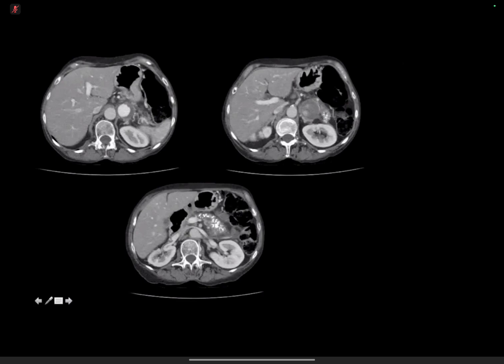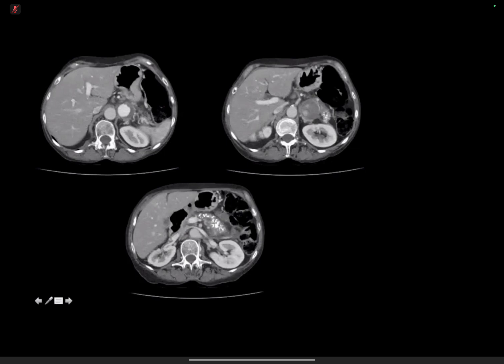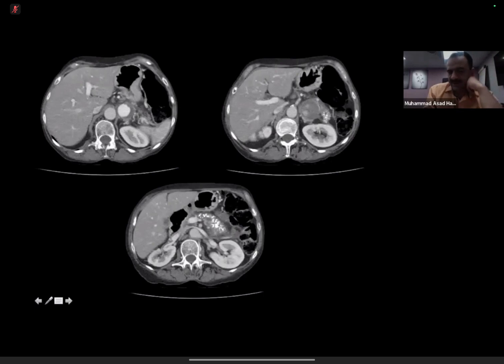Okay, it can be tricky to coil this huge aneurysm, but the classic treatment for a true aneurysm is coiling. Although there are other treatments, like maybe using a covered stent or a stent or balloon-assisted coiling or a flow diverter. Good. What size aneurysm would need treating? So the cut-off value I know is 2 centimeters. 2 or 2.5. It depends which center you are in. Normally, in my center, if it is more than 2.5 centimeters, we tend to treat them.